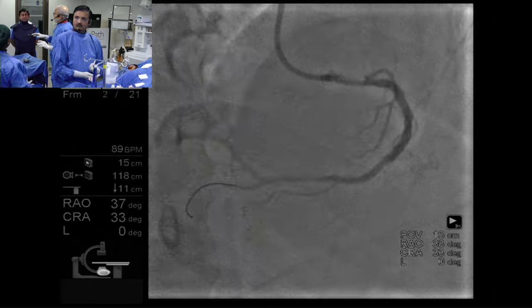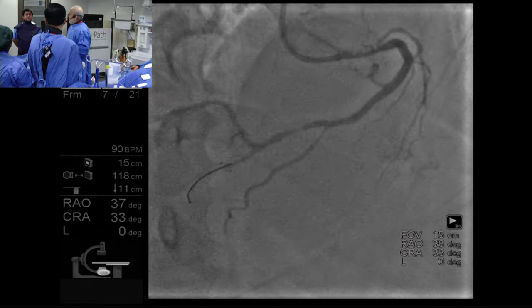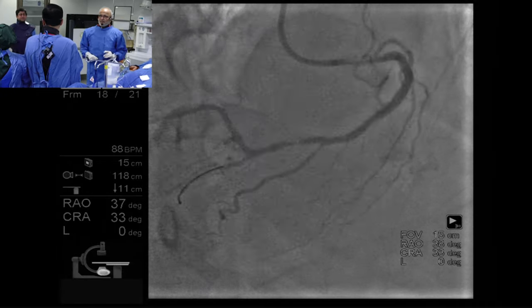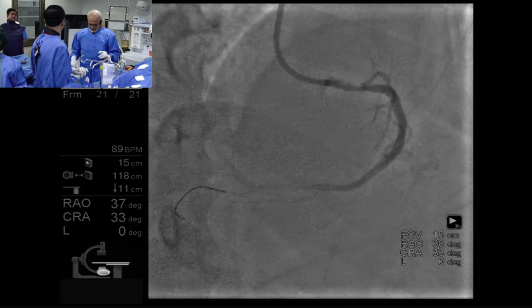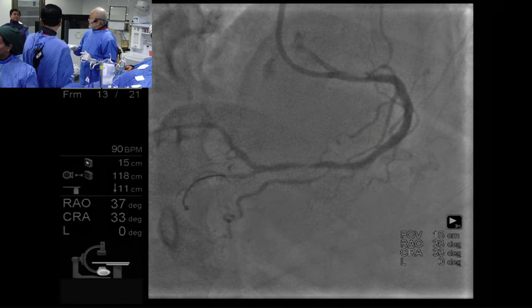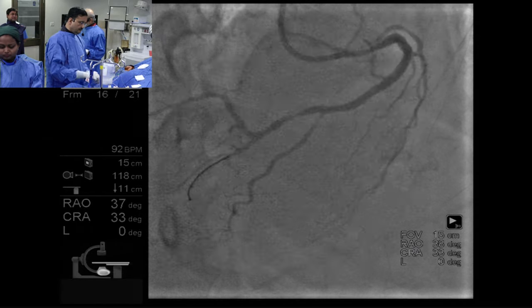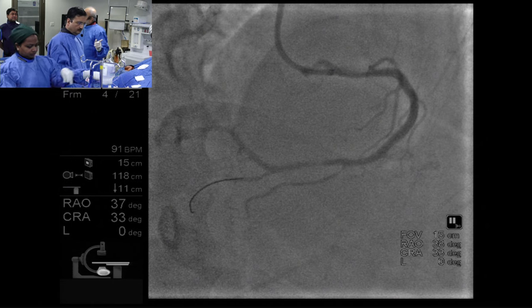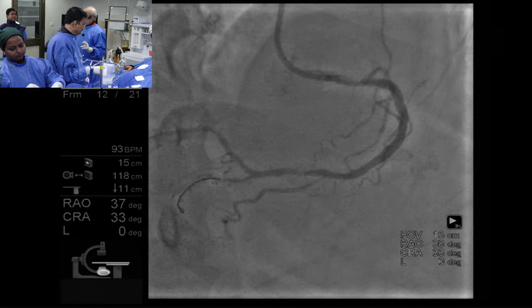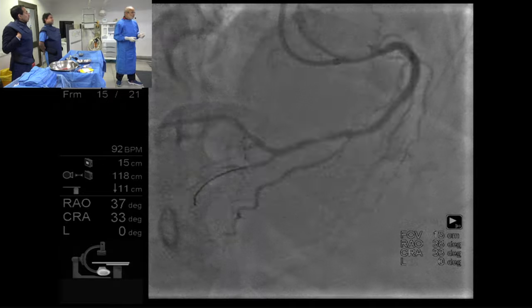We are giving quite significant heparin, 15,000. So we are at ease. And post-procedure, we will always check it. And if it is low, we give additional. Yes. Here, somehow, there are problems with thrombogenicity in this part. And at times, despite giving 15,000, in 1 out of 10 or 15 cases, post-procedure ACT is somewhere like 230 to 240. So, what is it?